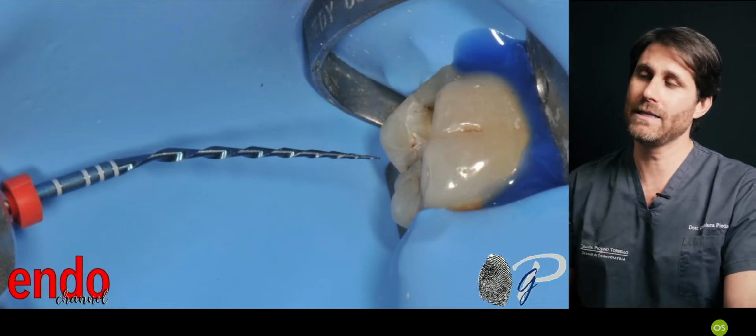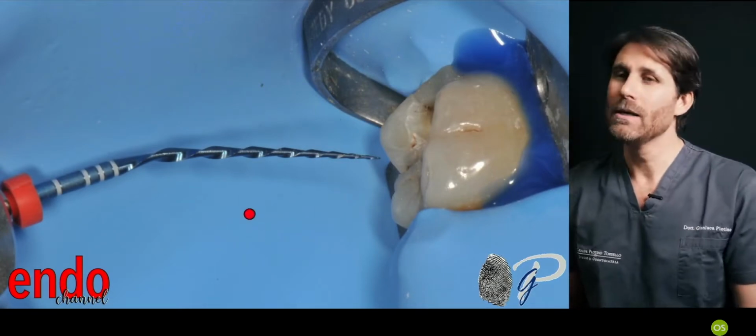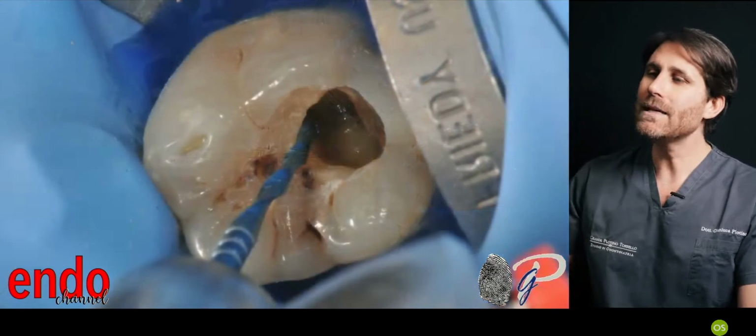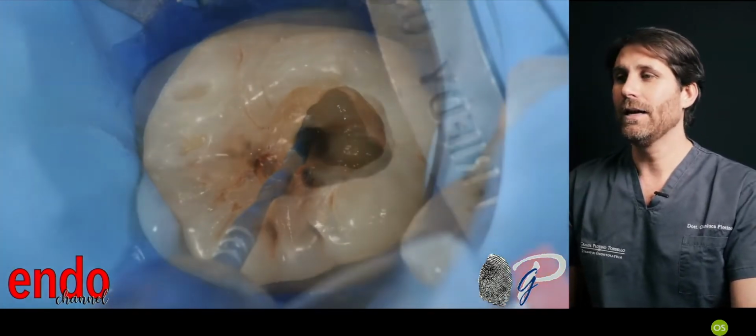So you need, in this case, instruments, nickel titanium files that are prebendable. So martensitic files with a high performance, so you can prebend and go inside the mesial root canals while preserving most of the mesial aspect. And this is very important.